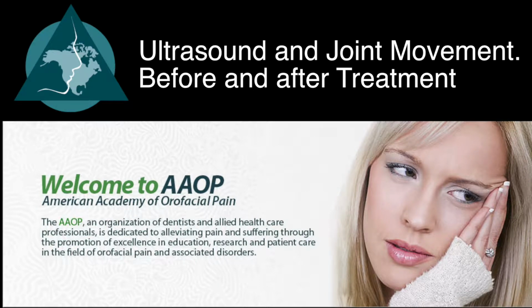Hi. I was wondering if you ever use ultrasound to look at joint movement before and after treatment. Yeah, I did. Well, not before and after treatment. I'll use it before. So, if I suspect they're not translating and the joint is stuck, I'll just look at it. But I can tell that from palpation a lot of times, so I don't necessarily need to use the ultrasound. The ultrasound's a tool, right?